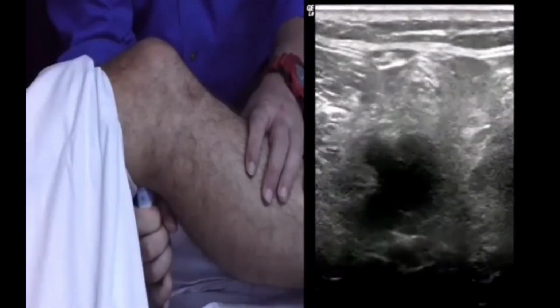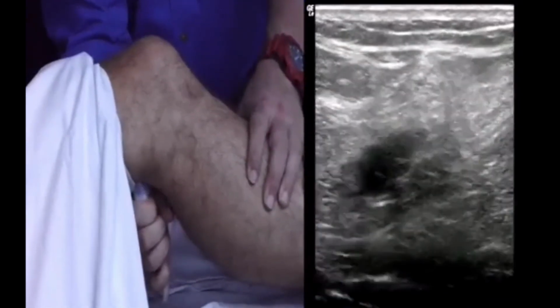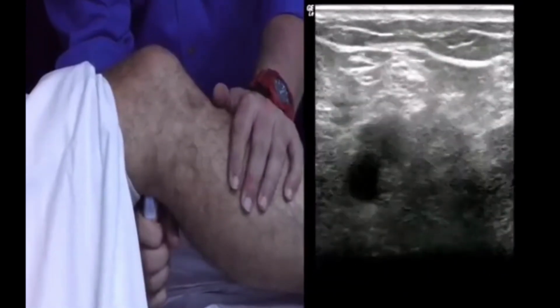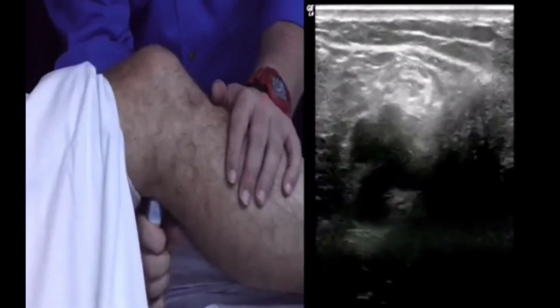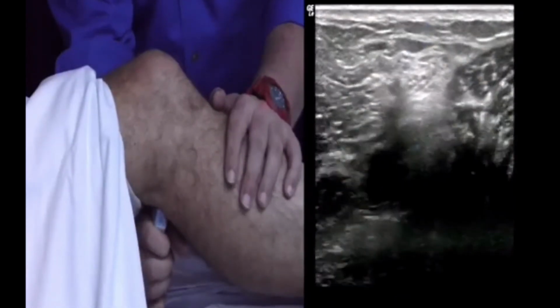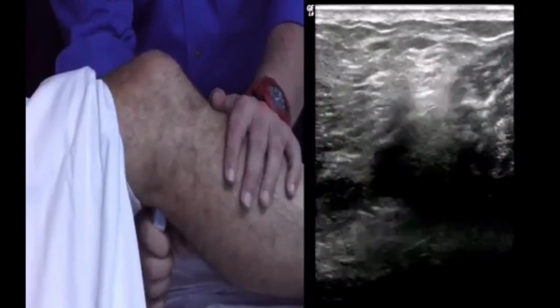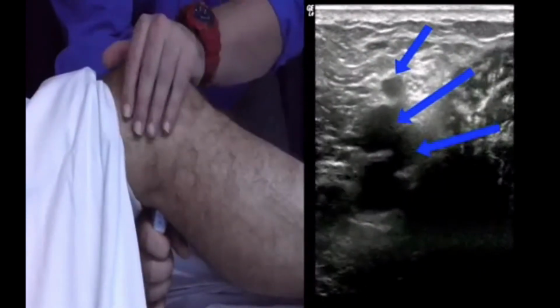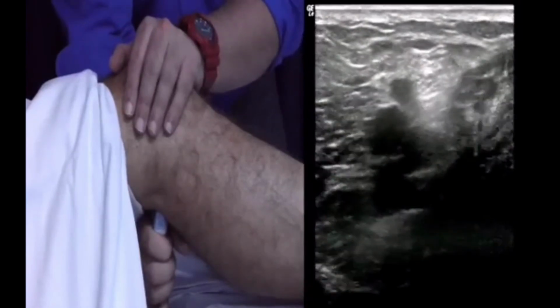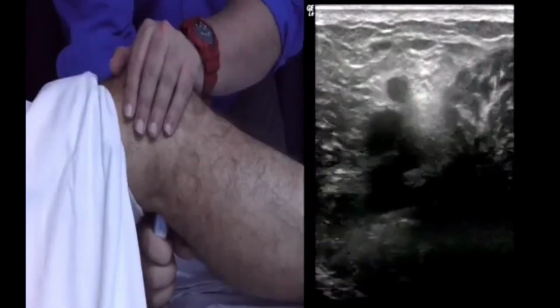And we'll follow this down all the way to the trifurcation to make sure all components of the venous system are compressible. You can see trifurcation here, and the venous system is obviously fully compressible when I apply pressure. A lot of times you can put your hand on top of the patient's knee to provide a little extra support, making it easier for you to compress the vessels and more comfortable for the patient.